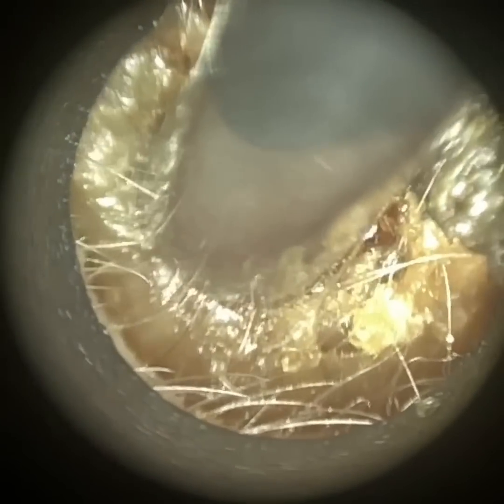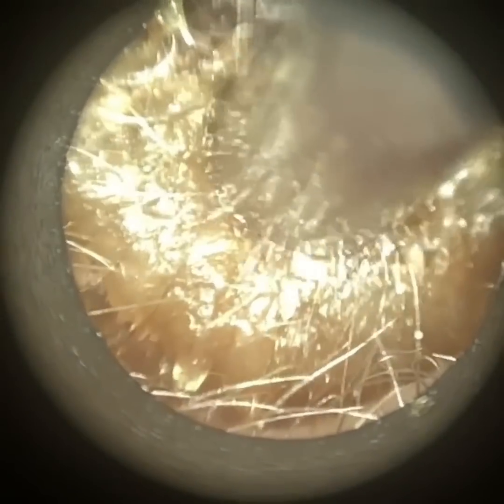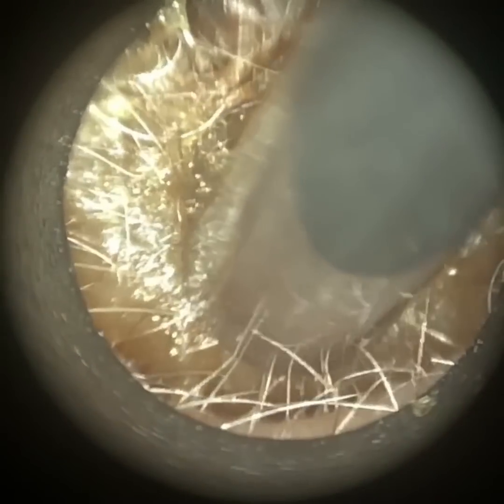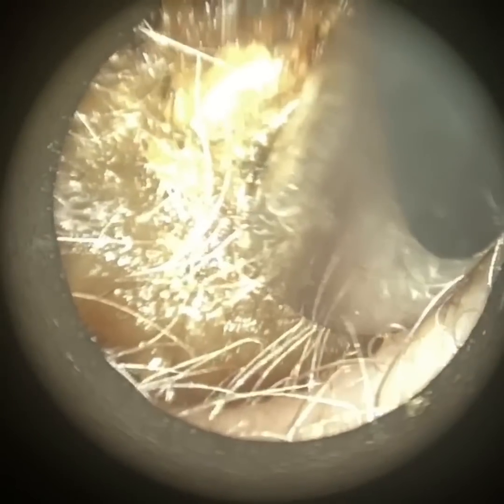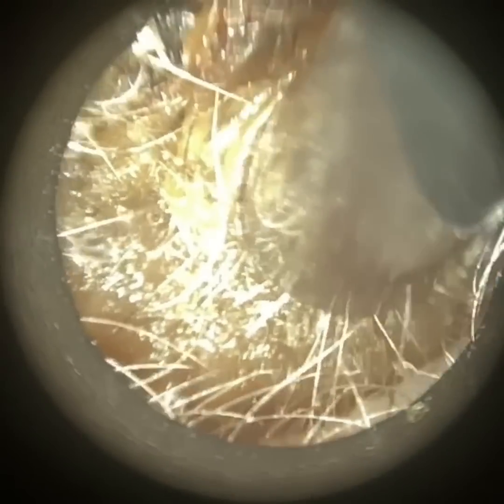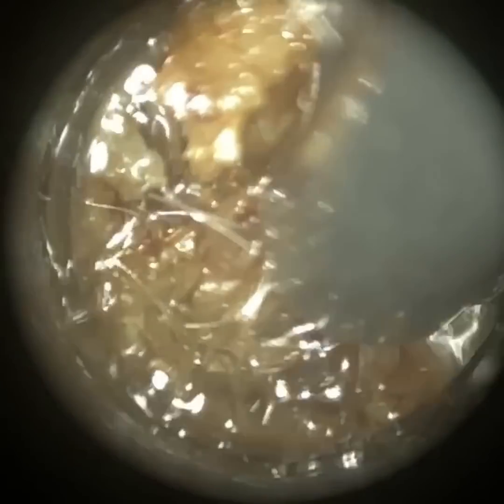So most of our ear canals have an upwards trajectory of, I think on average, around 32 degrees. And what happens with this patient, as we approach the eardrum, there's a sudden dip. So this patient's got quite a prominent inferior recess. There's a little trench basin at the floor where the eardrum is, and you'll see that at the end of the video. Now this keratin is really dry, so I've just put some medical grade olive oil spray.